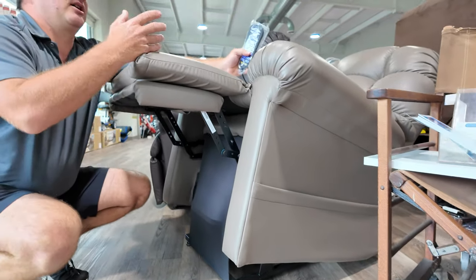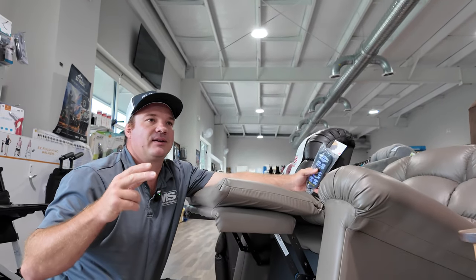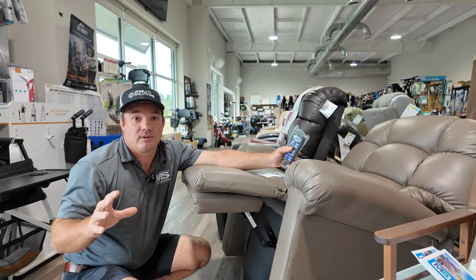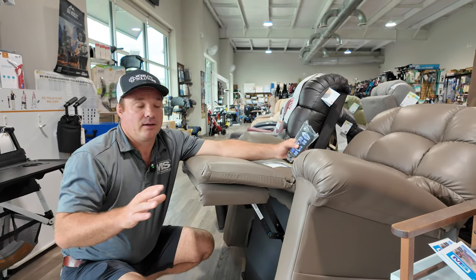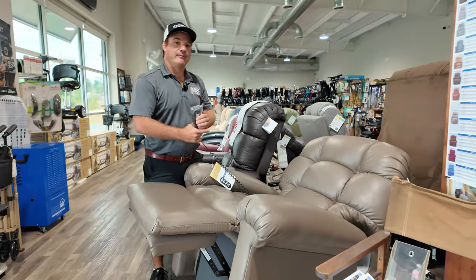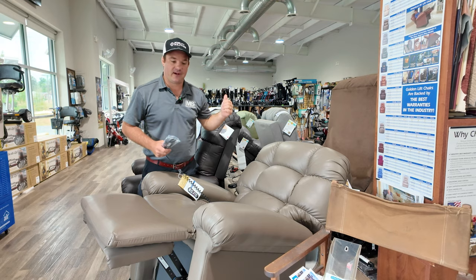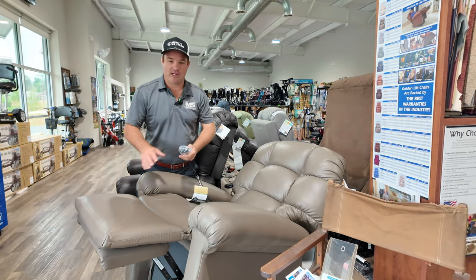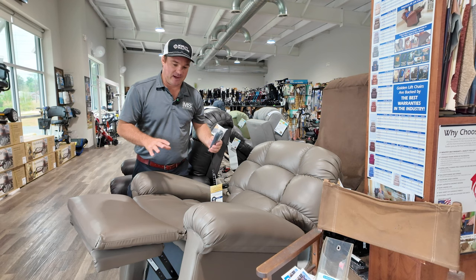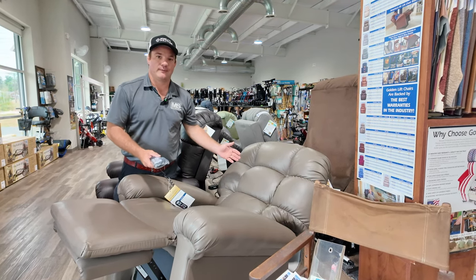Whatever position you're in — zero gravity, TV, sit — you activate this and you get into completely different positions. It changes everything. It doesn't have the massage feature like the PLR 4955, but if you're looking at a chair with feet above the heart, this one and the PLR 4955 are very competitive with each other on what people are looking for, but they're different chairs.